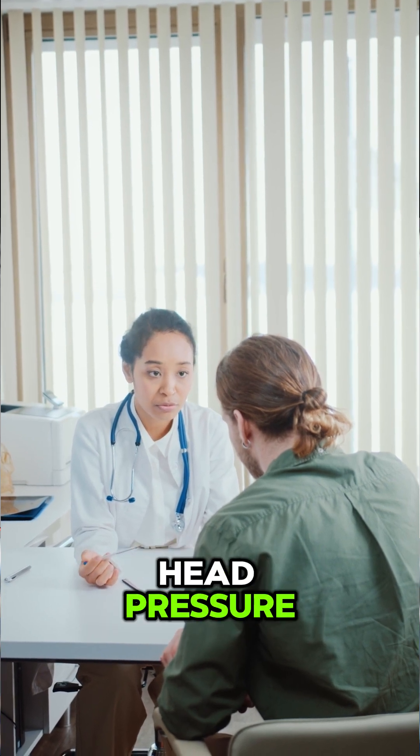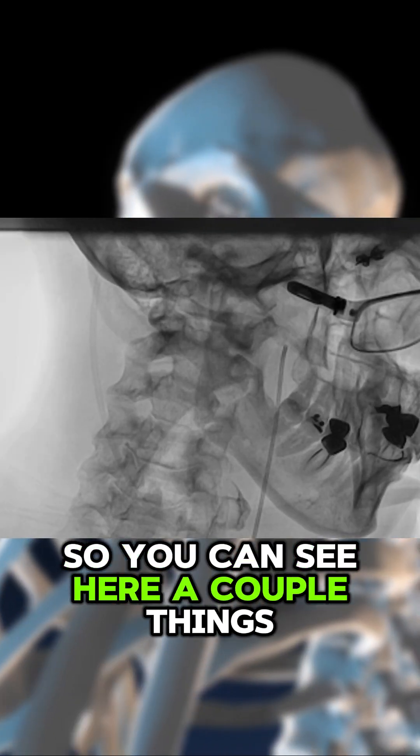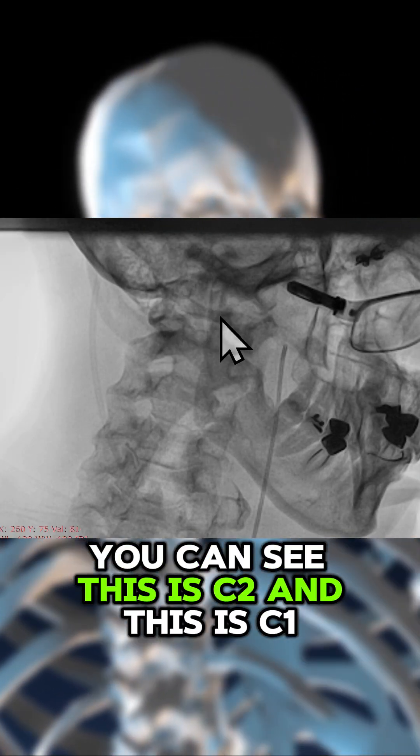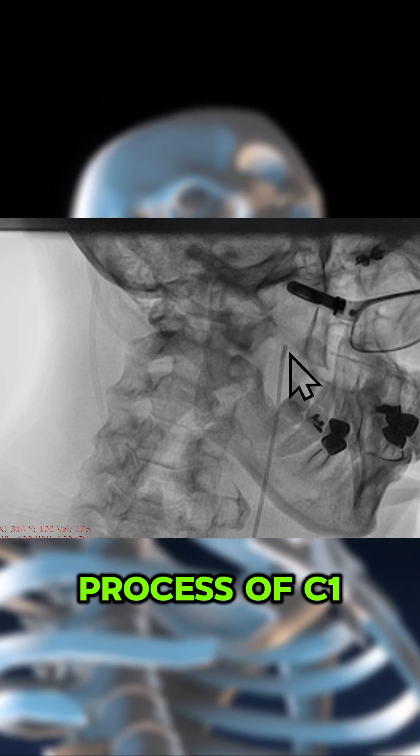Patients often complain of head pressure when they have C1, C2 instability. You can see here C2, C1, and the transverse process of C1.